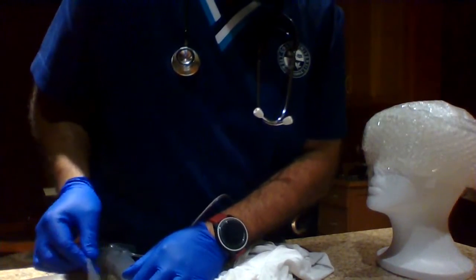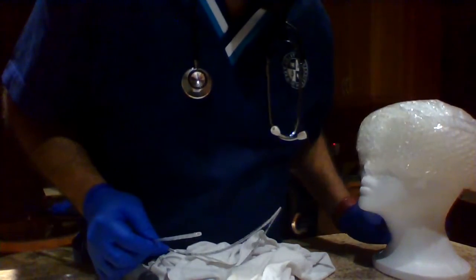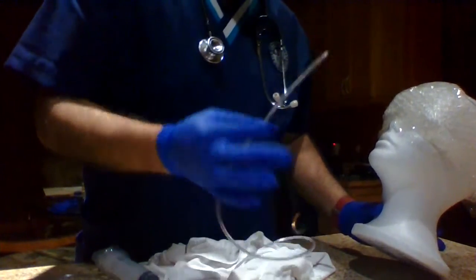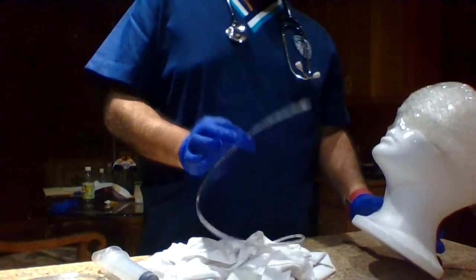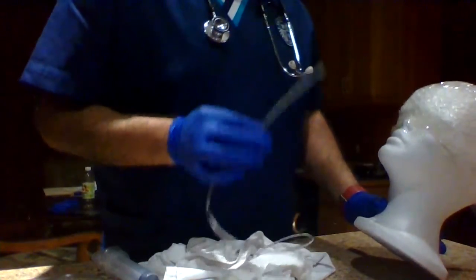Pretend we lubricate four inches. So now we're going to ask the patient to slightly flex their head backward, and then gently we're going to insert the four inches. This is just a clean technique. It doesn't require sterile gloves. I forgot to say that.